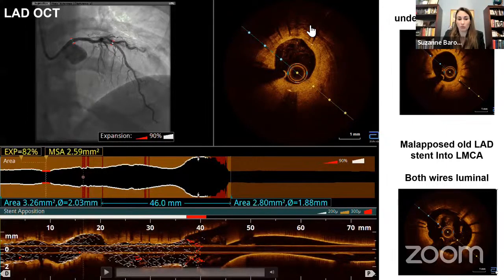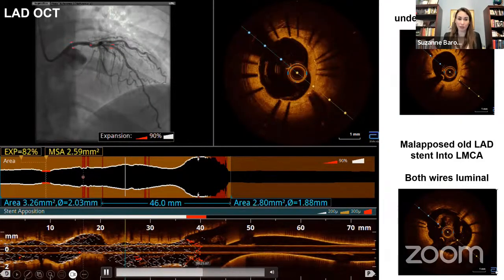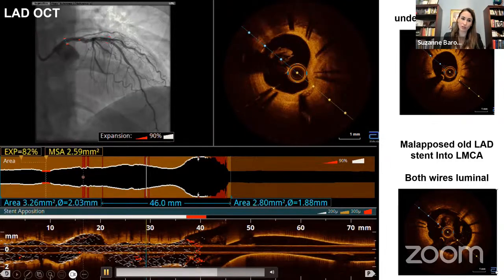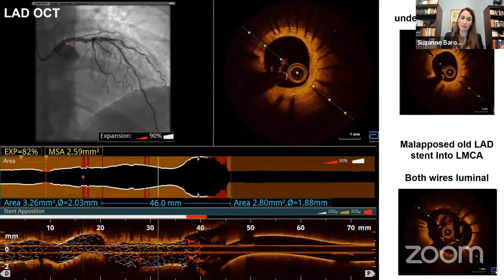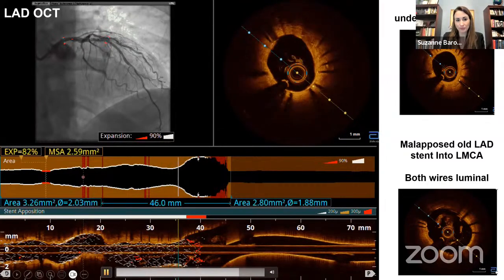If at some point you were considering some sort of provisional stenting into the LAD, I think this makes you think less about that, because you're going to end up having interaction of your stent going back from your circ to your left main. So I would certainly be thinking about a 2-stent strategy here.